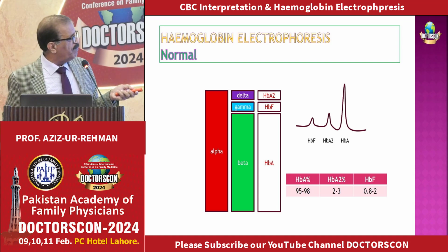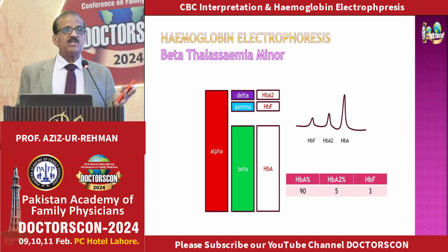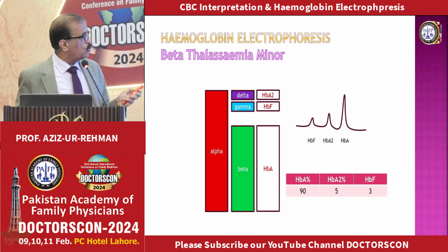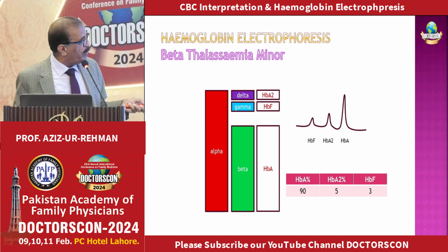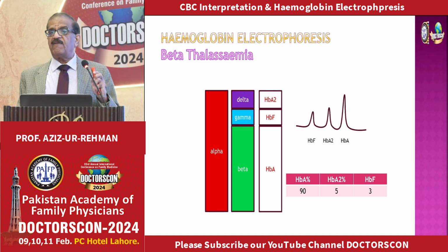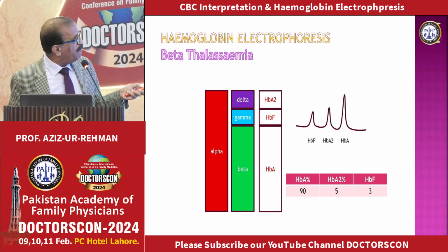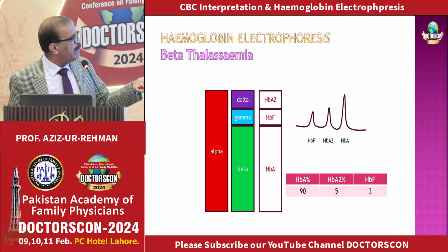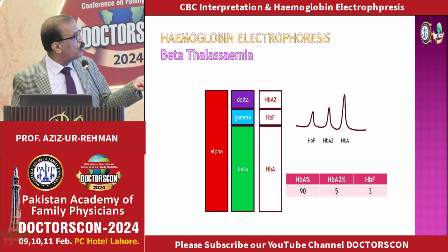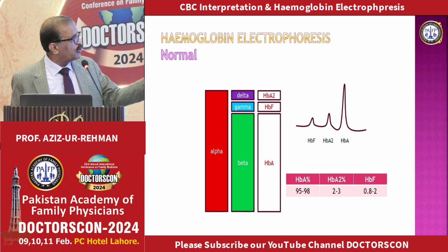I'm going to show you what happens in beta thalassemia. So in beta thalassemia, this beta chain is reduced. By definition, in thalassemia, there is a quantitative defect. Beta chains are normal, but they are reduced in quantity. And so there will be reduced hemoglobin A. But there can't be any space here, because proportionately gamma chain and delta chain will be increased in production to keep it balanced with alpha chain. So since gamma and delta are increased, hemoglobin F and hemoglobin A2 will be increased. Hemoglobin A will be reduced, as shown here in the percentage. Hemoglobin A2 is increased, hemoglobin F is increased, and this graph will also change.